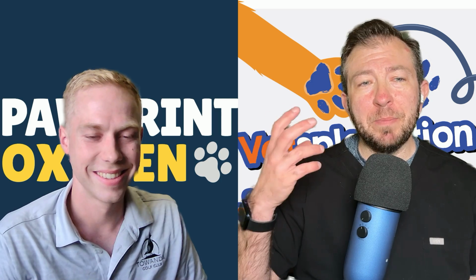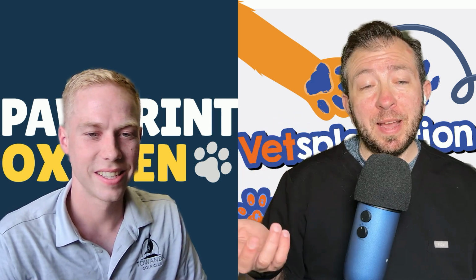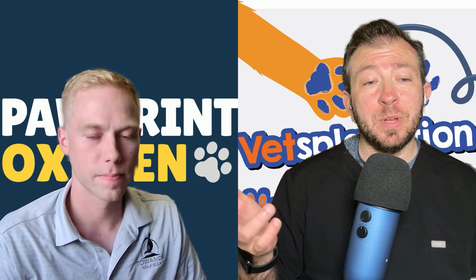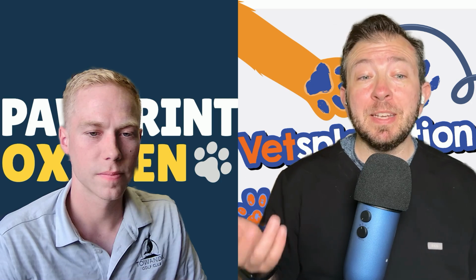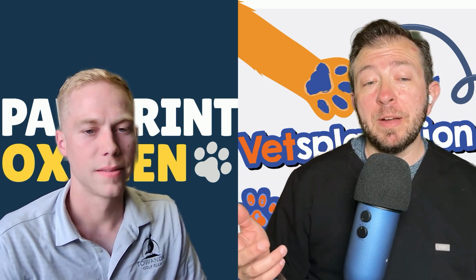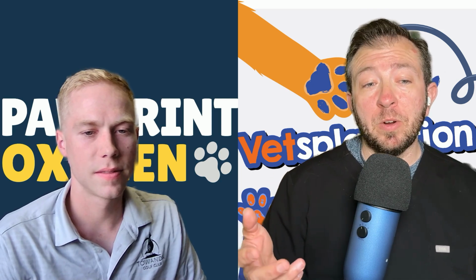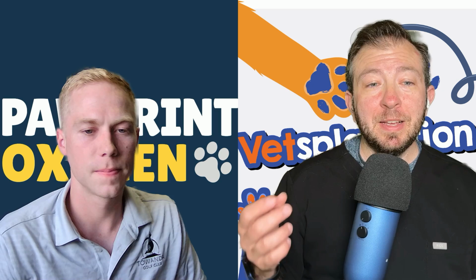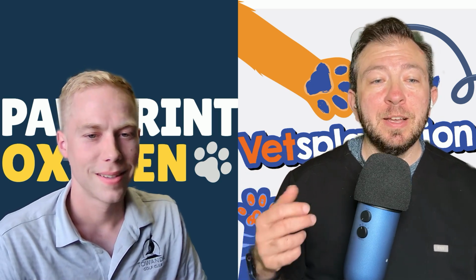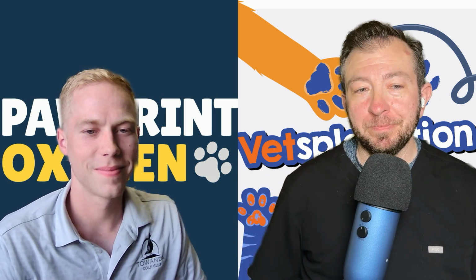You were mentioning the mask too with cats. When they have asthma, a lot of times they're already getting an inhaler that's given through a mask, so a lot of those cats have luckily already been conditioned to having a mask on them. And even then, we talk a lot about how to help condition them, by putting catnip in it or treats or something that smells really good in it.